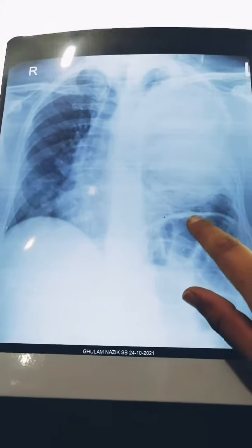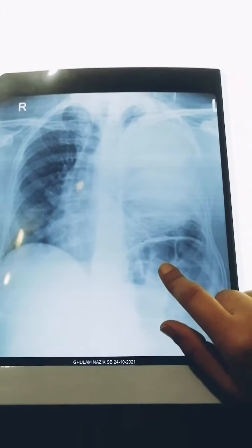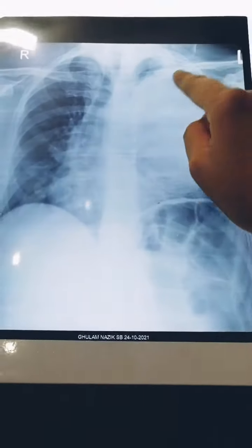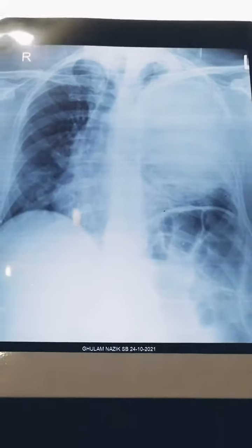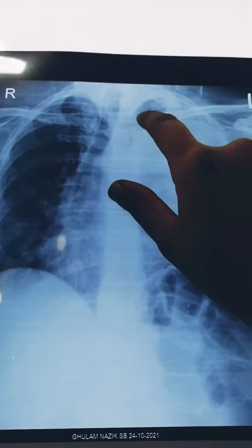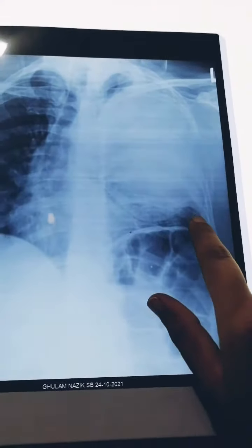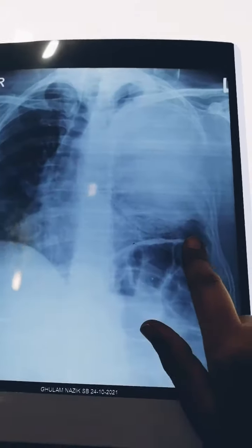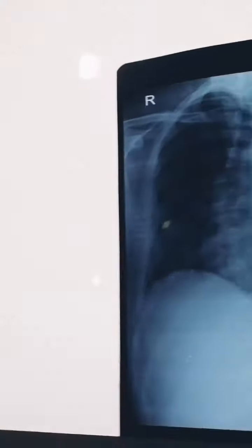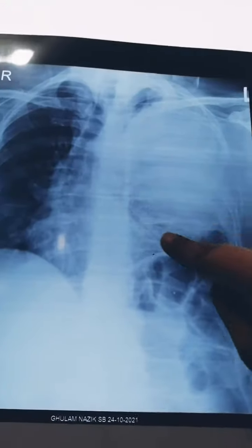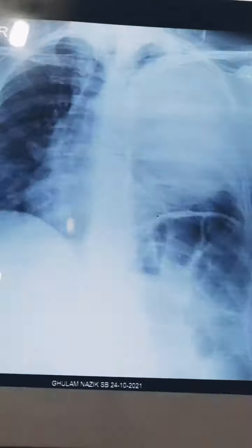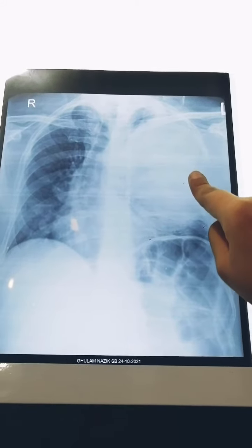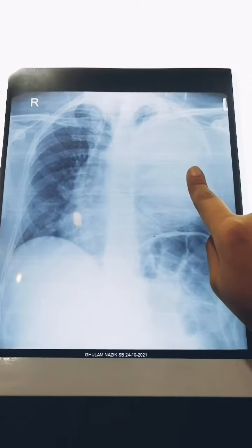This is an X-ray of the chest. You can see the right lung is normal, but in the left lung there is opacity. The upper pole is clear slightly and the costophrenic angle is also clear — there is no shadow there. It is mainly affecting the middle part, and there is homogeneous opacity in the left lung.